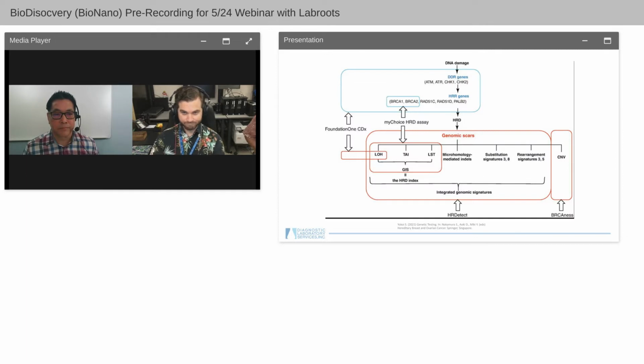Thank you, Dr. Lum. So our next set of slides is going to discuss how we are leveraging summarizing software and leveraging what we can use as far as moving away from a traditional array methodology to using next generation sequencing, massive parallel sequencing here.